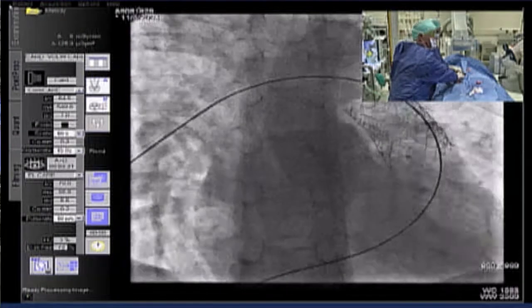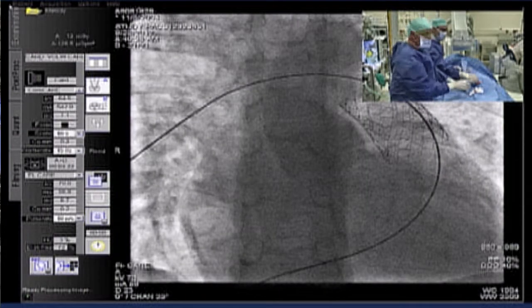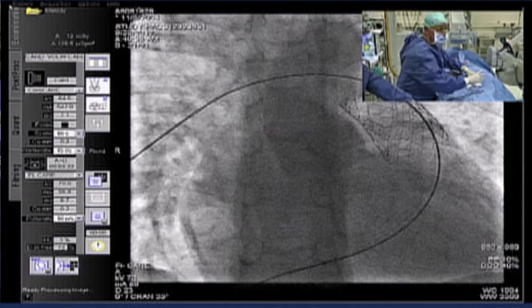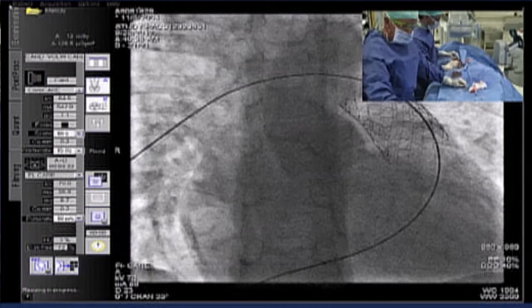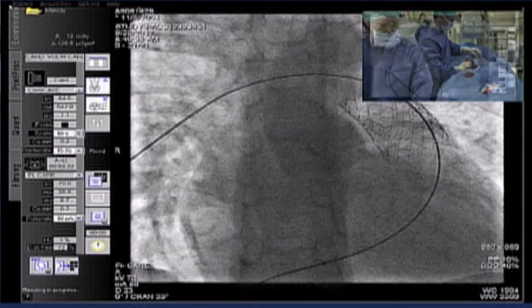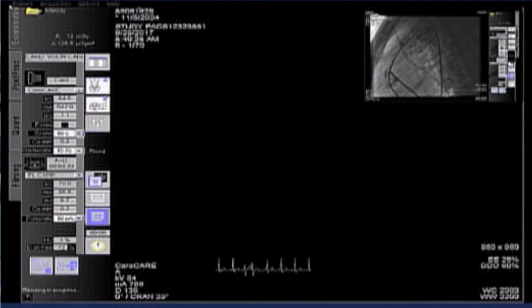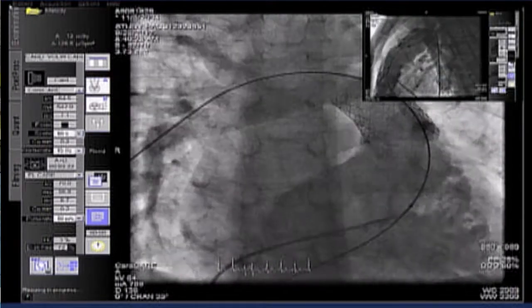Can we see the frontal and the lateral pictures instead of your pictures, guys? Okay. Can you show the picture? So both radio pictures, the lateral and the A and the B. Thank you. So this is, you see. Play back the angios, yeah.